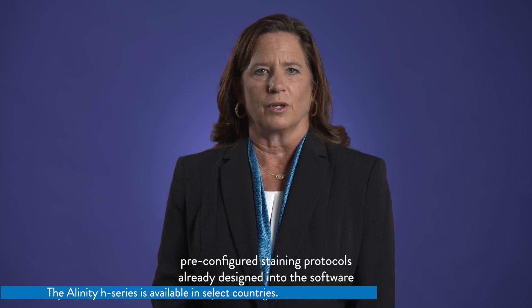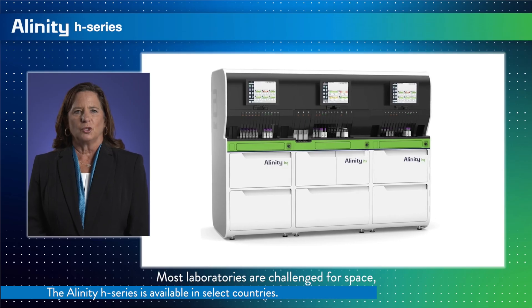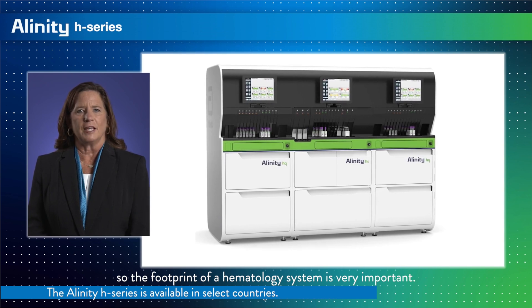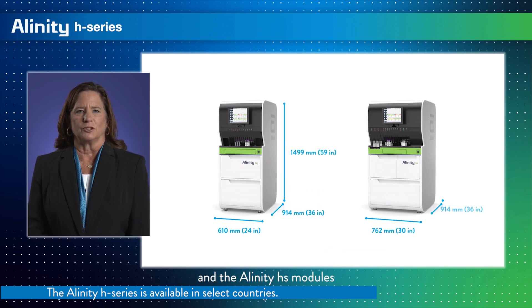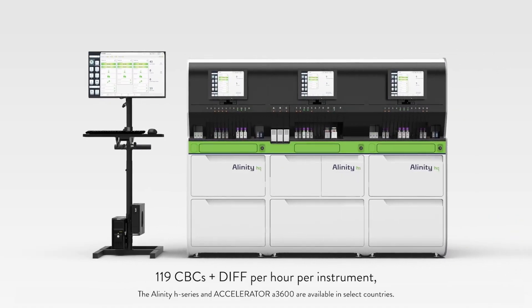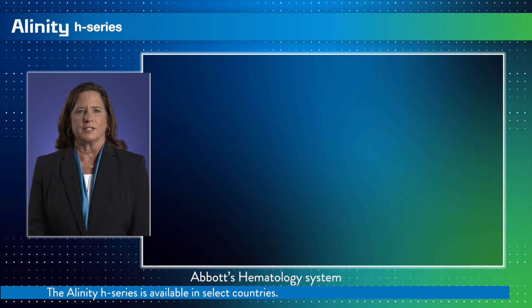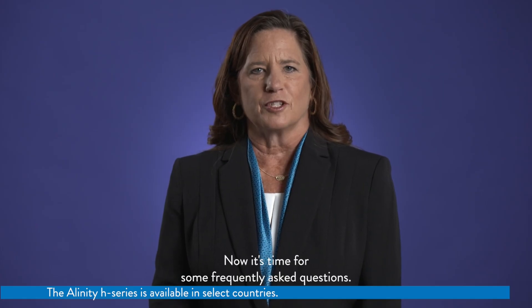Both Mayer-Grünwald Giemsa and Wright-Giemsa stains have multiple pre-configured staining protocols already designed into the software, with the option for additional customized stain protocols as well. Most laboratories are challenged for space, so the footprint of a hematology system is very important. The dimensions of the Alinity HQ and the Alinity HS modules were designed to be quite compact. In closing, with a throughput of up to 119 CBCs plus diff per hour per instrument, an integrated bidirectional conveyor creating built-in automation, and the capability to connect to the Accelerator A3600, the Abbott Hematology System is designed to offer the efficiency of big automation in a very small footprint. Now it's time for some frequently asked questions.